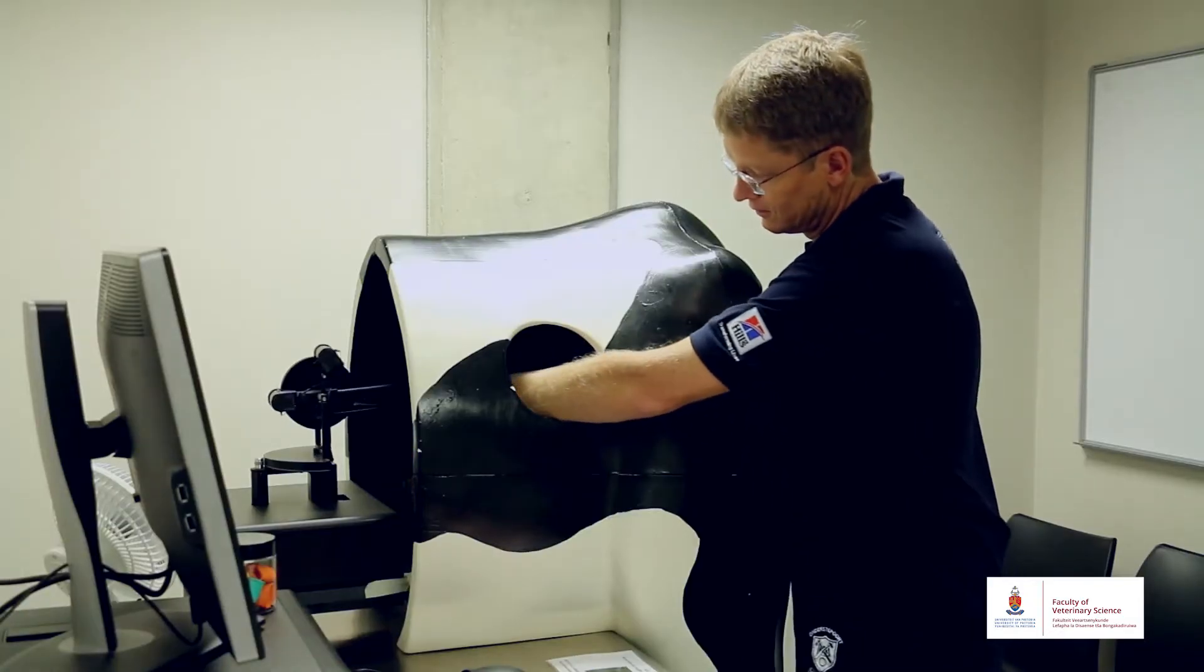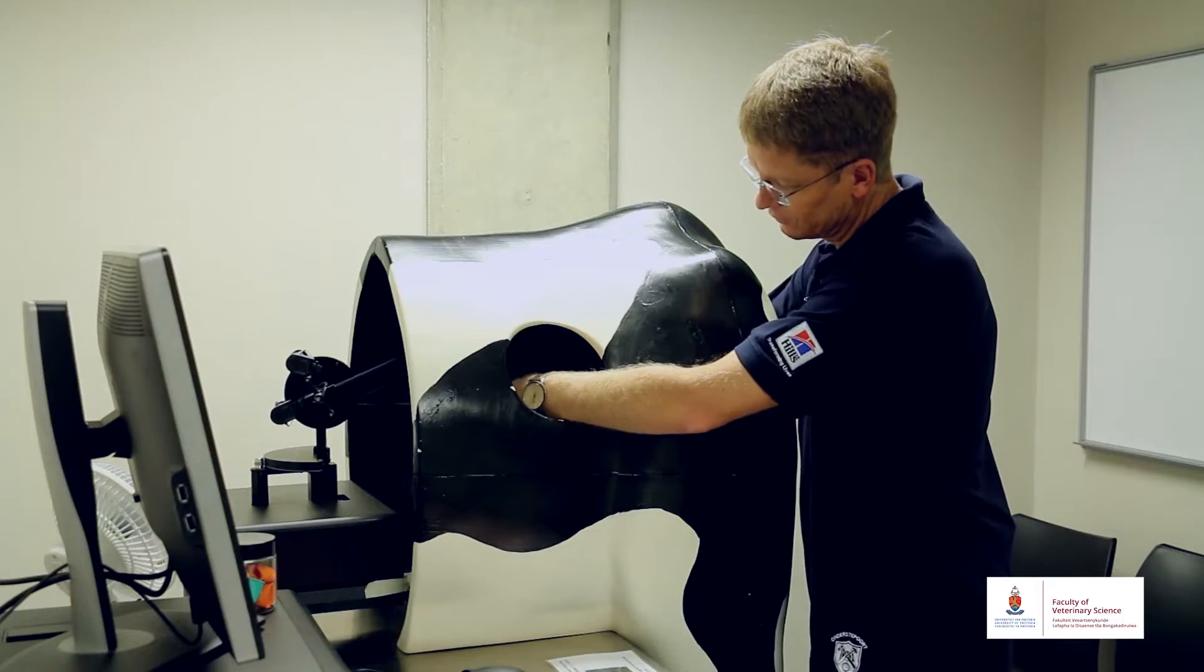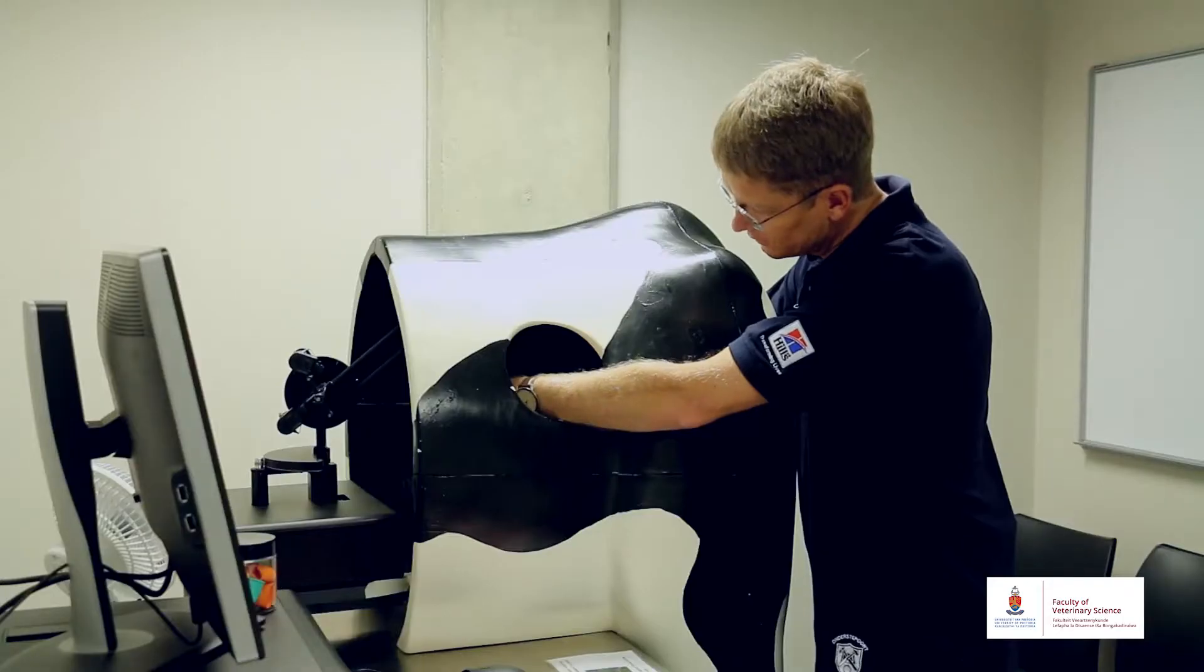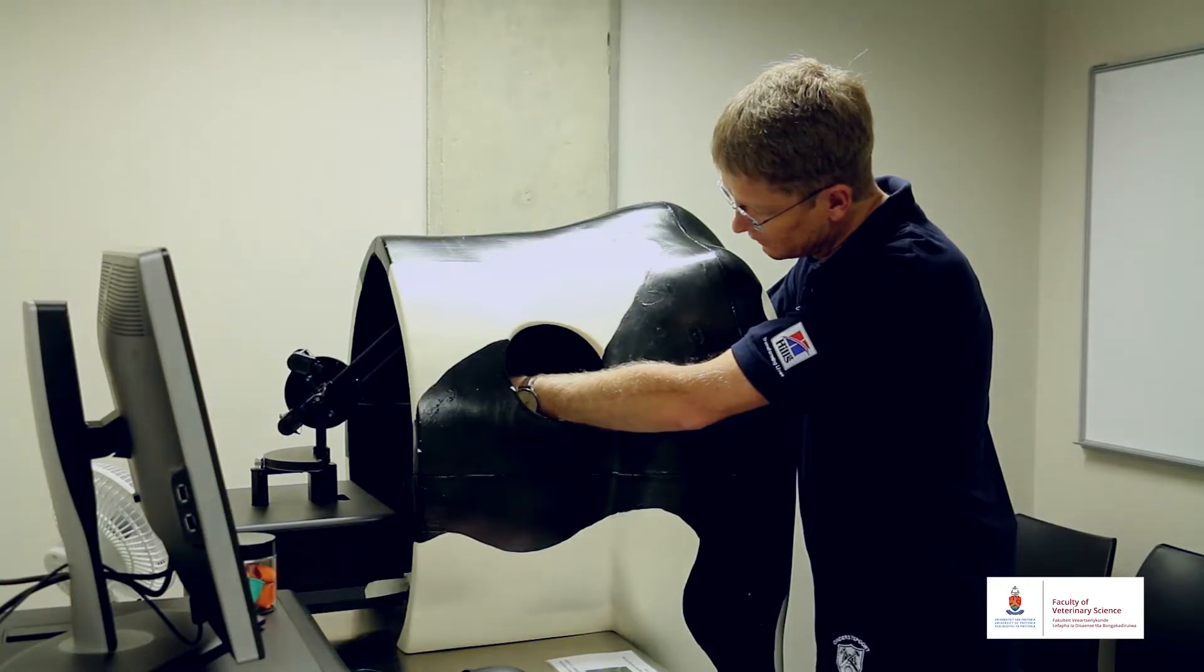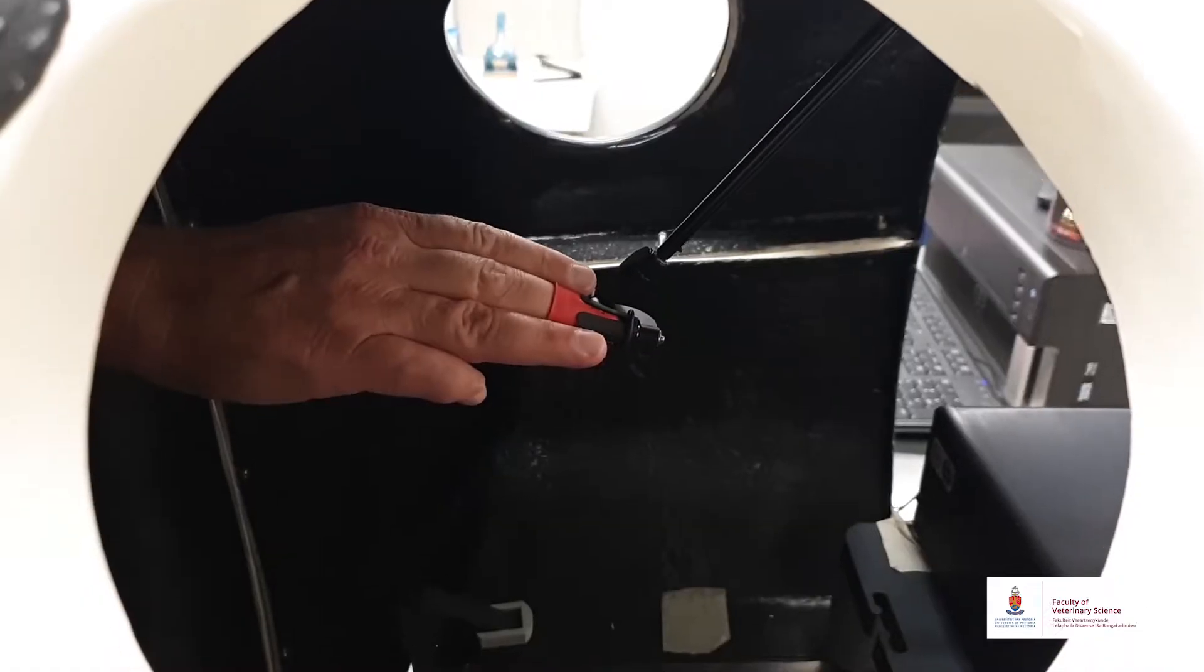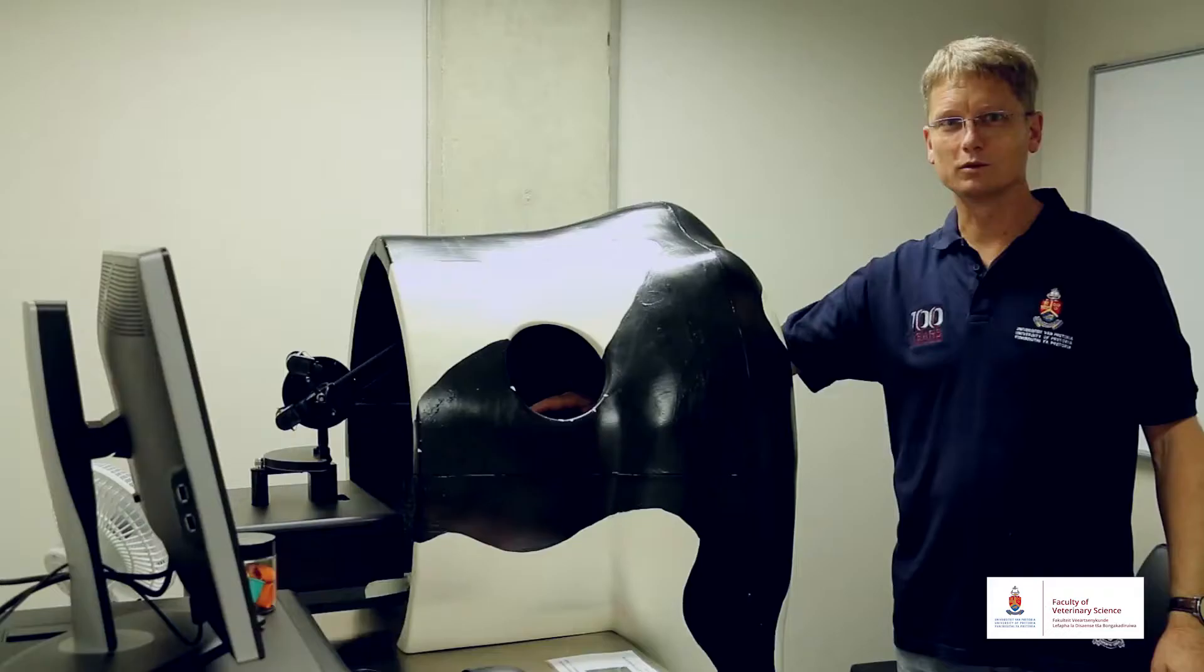On the inside there is a device that I have to connect my finger to that will control the movement of my hand so that it will train me how to palpate, how to do a rectal palpation on a horse or on a cow.